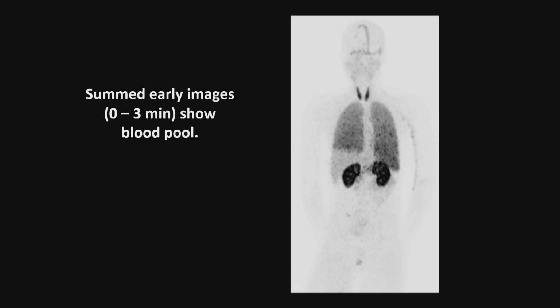The venous drainage of the brain goes into these very large veins, so big that they are called sinuses. So we're able to see the blood in the sinuses as the draining veins of the brain, and we can see it because there's no uptake in the brain. Most of the radioligands that I develop go into the brain, so by contrast we can't see it. Okay.